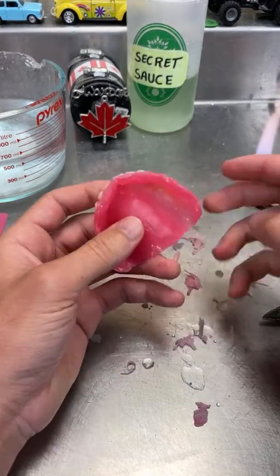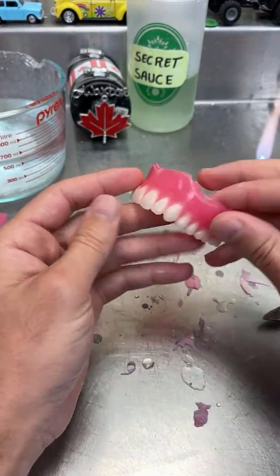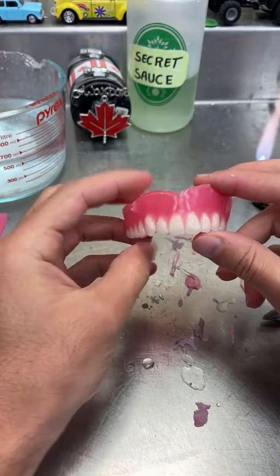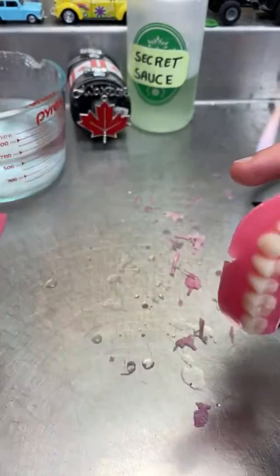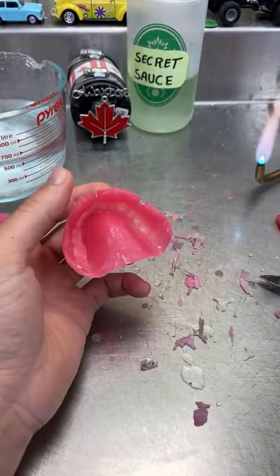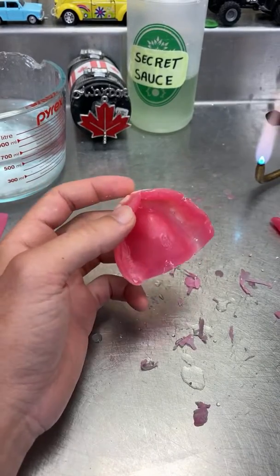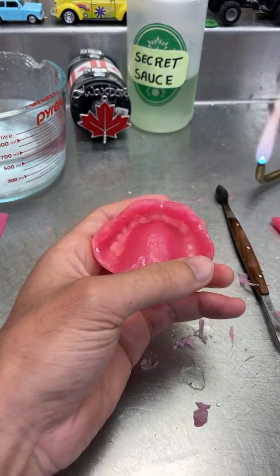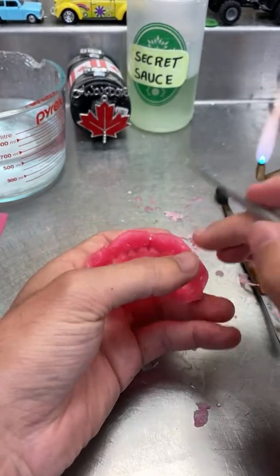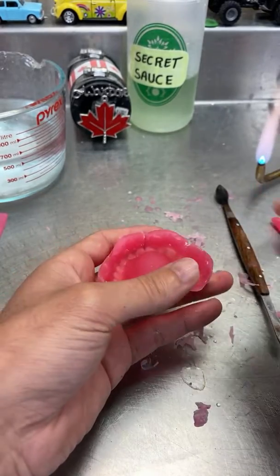So now it's time to trim those edges here, because you can see they're rough, they're overextended, because our impressions are always overextended for safety, and then we can trim it down. Just trying to get that stone out of here, because then it will mix with the wax.